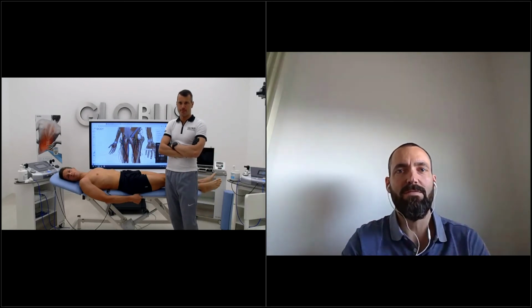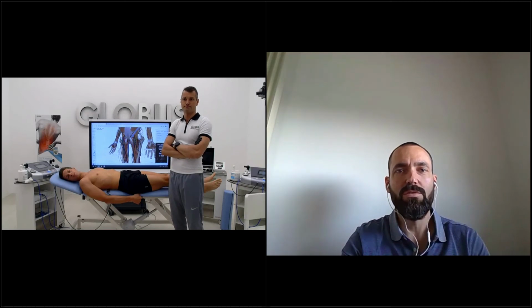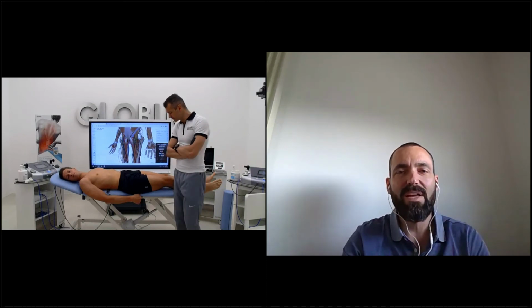To answer that question, I think it's possible to combine all of them. It's not a problem, but of course you have to make an evaluation and think about what we want from this tissue. If you do everything that is possible, we cannot even understand afterwards what is really helping. Maybe if you do a really hot treatment and then shockwave, you can have a reaction because it's too many things altogether. But if you know that this is what that tissue needs in that moment, it's possible to do.